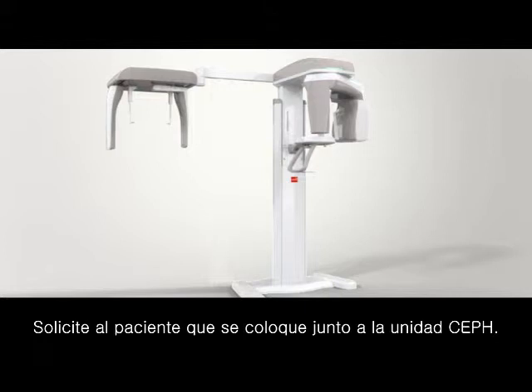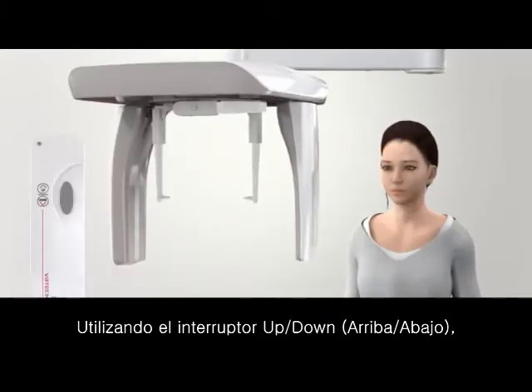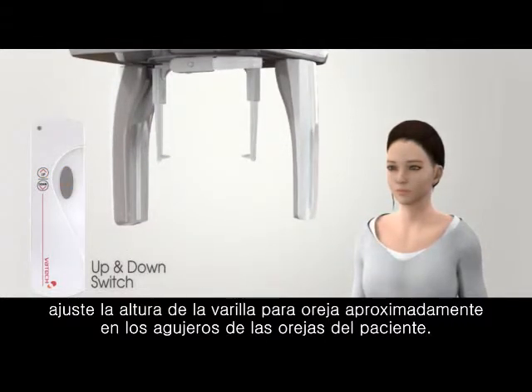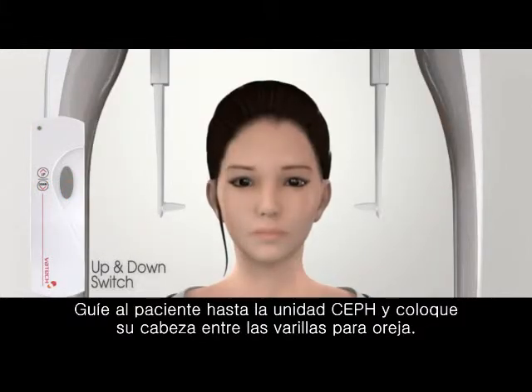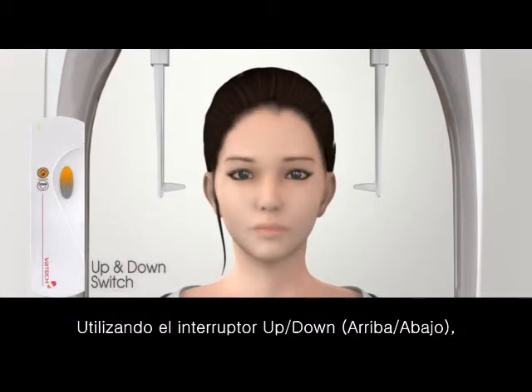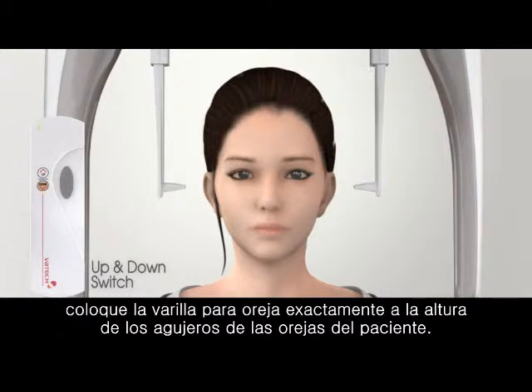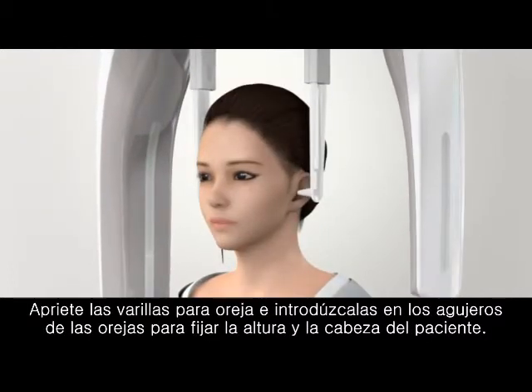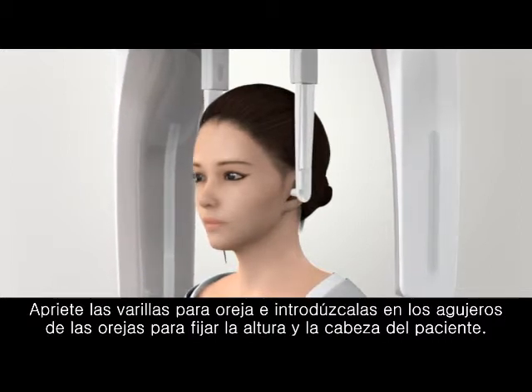Ask the patient to stand next to the ceph unit. Using the up-down switch, adjust the height of the ear rod at the patient's ear holes approximately. Guide the patient into the ceph unit and place the patient's head between the ear rods. Using the up-down switch, position the ear rod at the exact patient's ear holes level. Tighten the ear rods and insert them into the ear holes to hold and fix the patient's head and height.